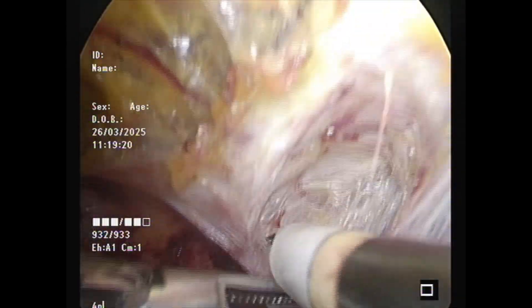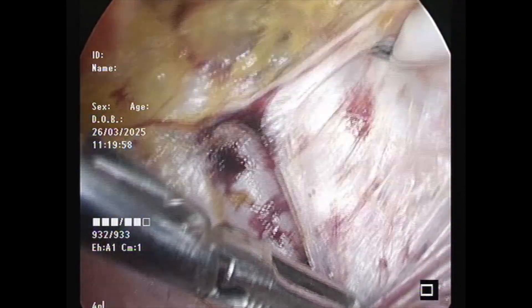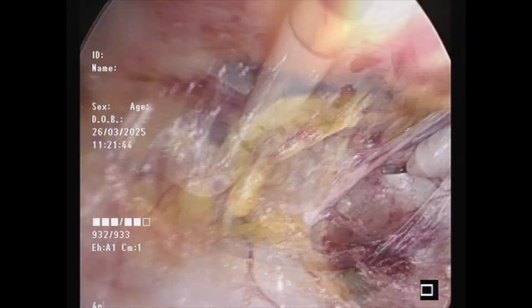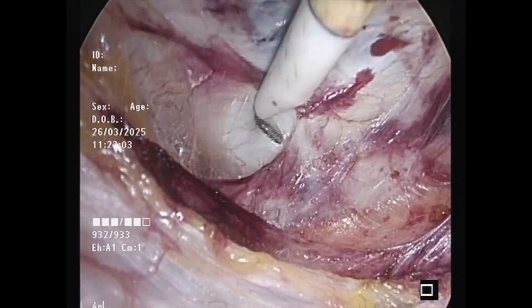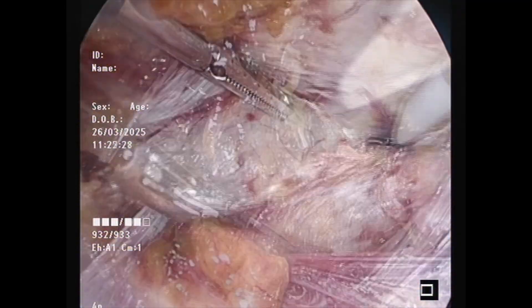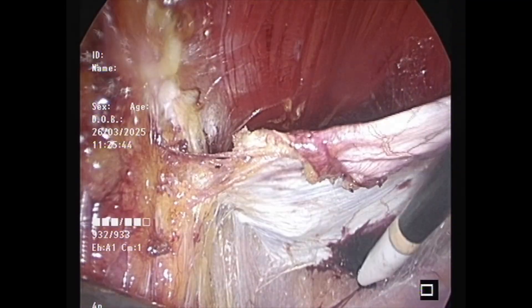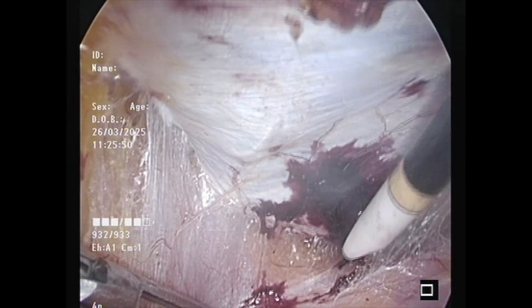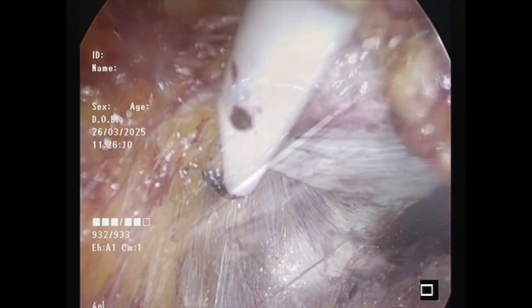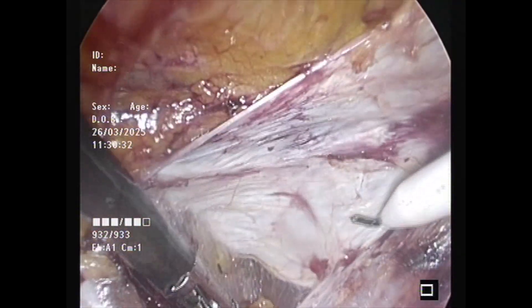Fibre by fibre, you can pick up the transversalis fascia. Here I am dissecting on the right PRS — you can push the PRS superiorly, pick up the fibrous layers, and you can see the transversalis fascia here. I am picking it up, seeing the shiny PRS superiorly, and then dissecting the peritoneum as well as transversalis fascia away from the PRS. One should not be putting pressure on the peritoneum with the hook; instead one can push the PRS away and then pick up the fibrous bands.